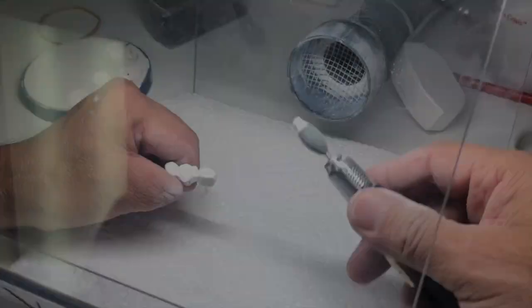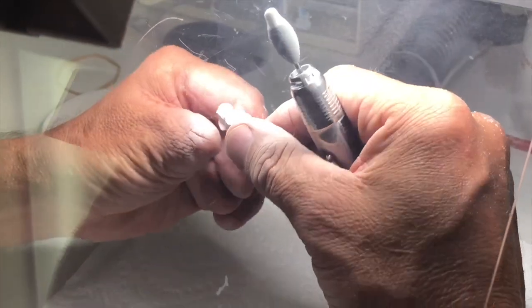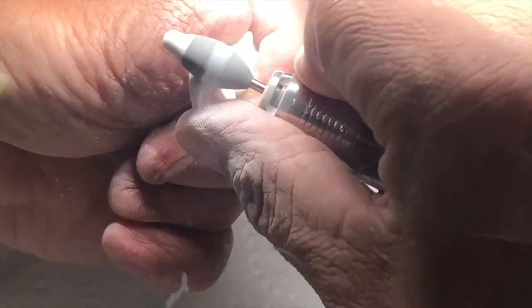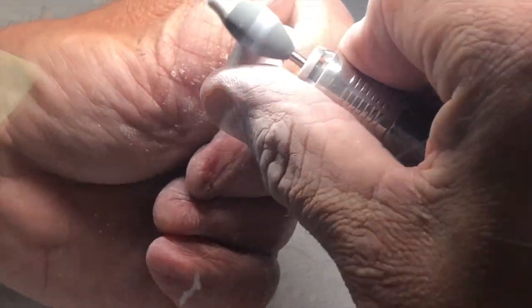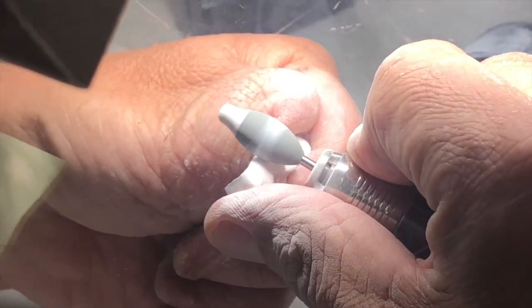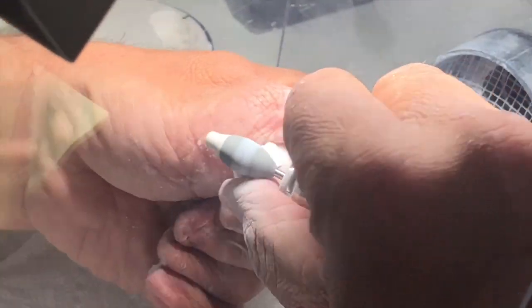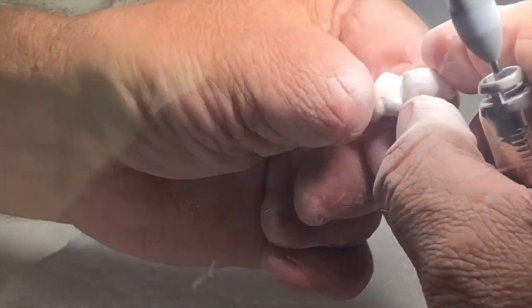Then I'll take my GS contouring stone — my green stone — and I will go all around the actual walls of the restoration. I stay clear of my contact area, but I can get down close to the margins. I can also use that white tip to do the occlusal surface, and they also come with other tips that you can use for the occlusion.